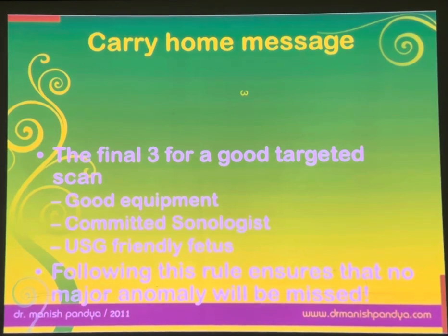You want to do the fetal cardiac examination and the spine is anterior. Believe me, you are not able to see the heart properly. You have to see the heart from the lateral scan. Don't do this type of juggling. Tell the patient to come after 15 minutes, have a coffee or climb stairs one or two times. When the baby moves from spine anterior to spine posterior, do the fetal heart scan. So the baby should be friendly. Following this rule, ensure that no major anomaly is missed.